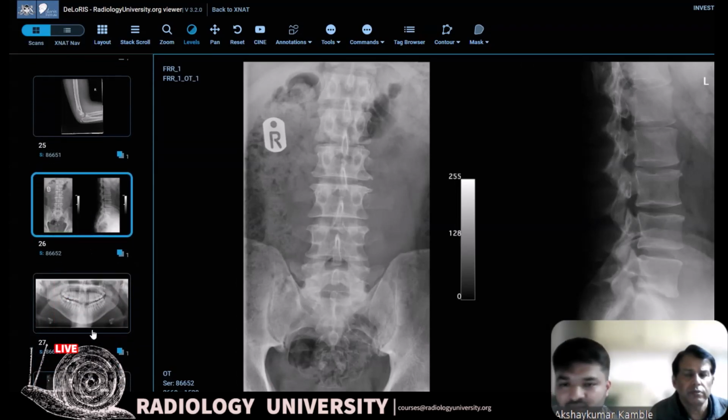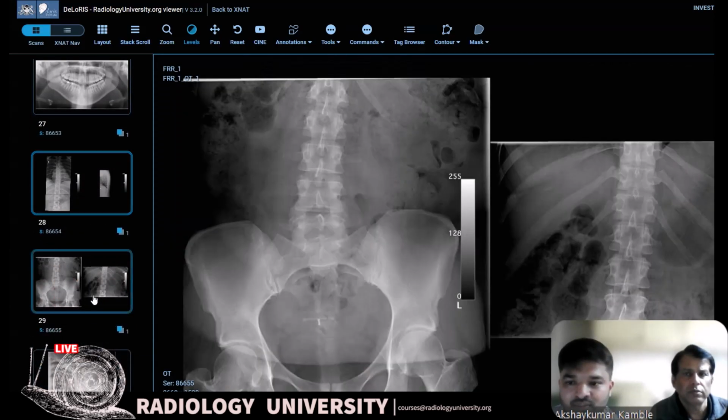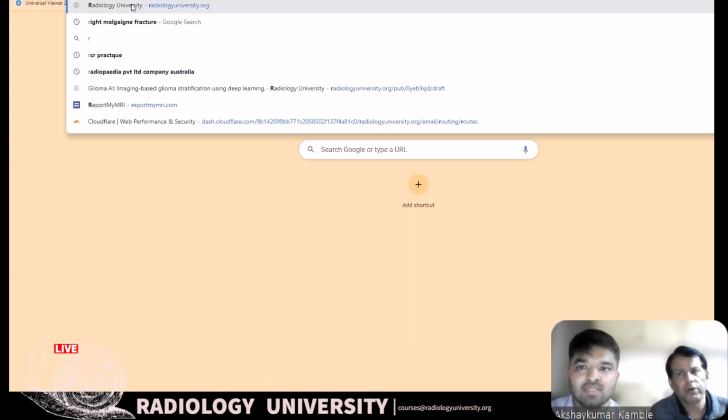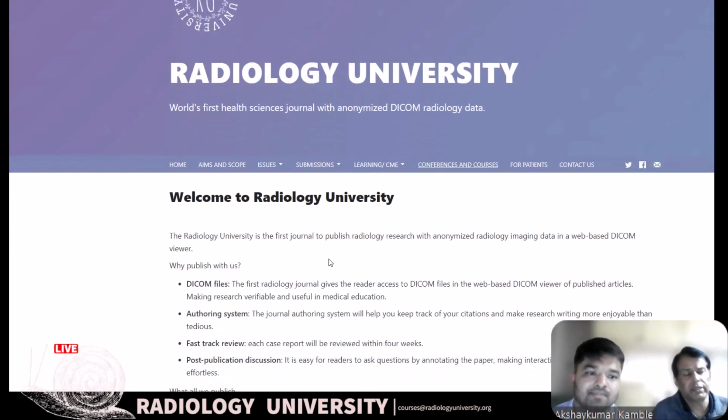26 was normal. 27 was normal. 28 was normal. 29 was normal, and 30 was normal again. So you can see that there was about 1, 2, 3, 4, 5, 6 normals in a given row. Yeah. So that's why you have to be careful. It doesn't matter in exam. It will be how confident you are.